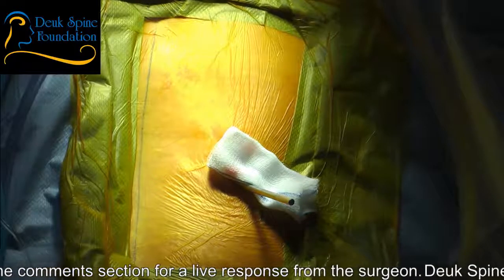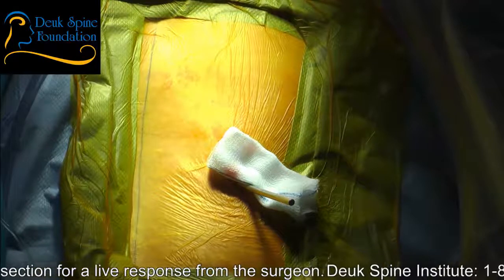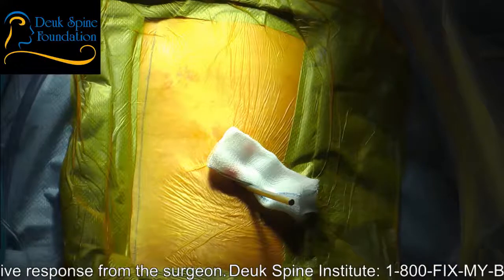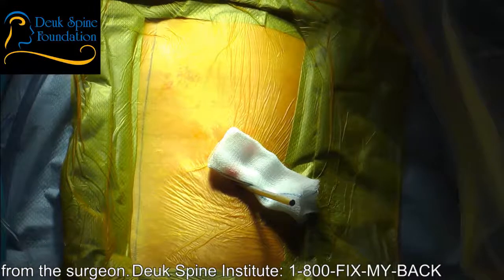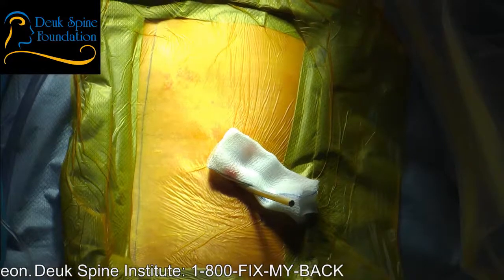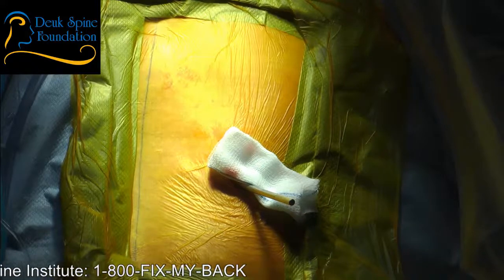So I knew I was under the root. And then I just brought my dilator in there. I planted it under the root, put it right on the disc, and then I just put it in once he's asleep. By doing that with him asleep, he's relaxed. He's not feeling the pain of the procedure. So his muscles relax in his back, and that allows the disc to open and the bones to spread apart. So it allows me to get in easier. And that's what we did.